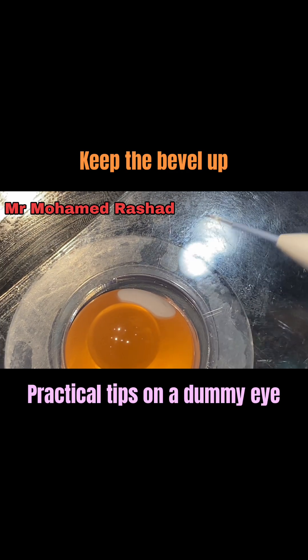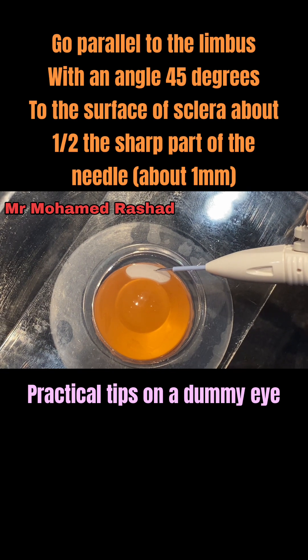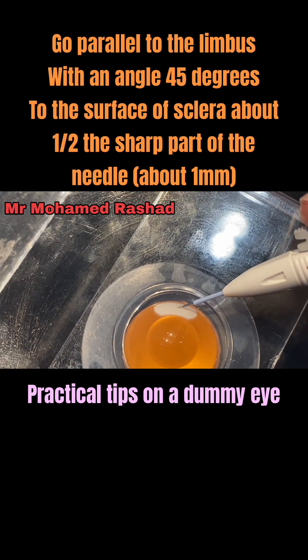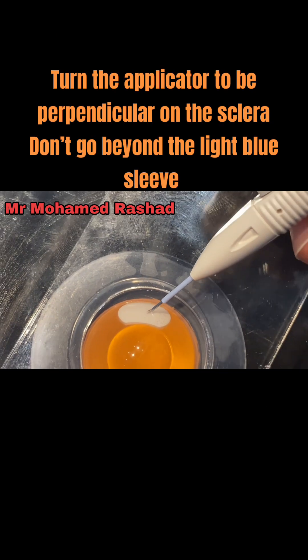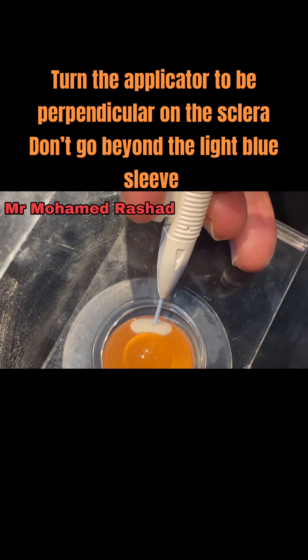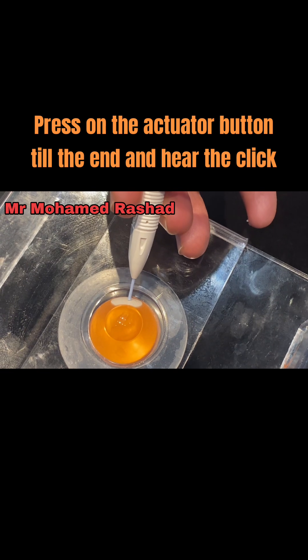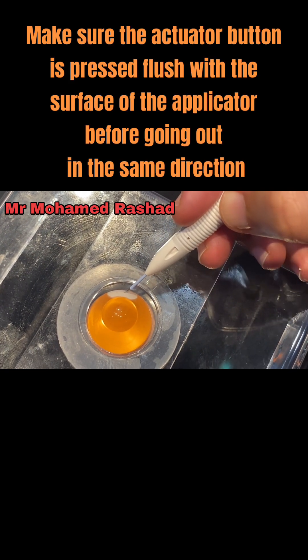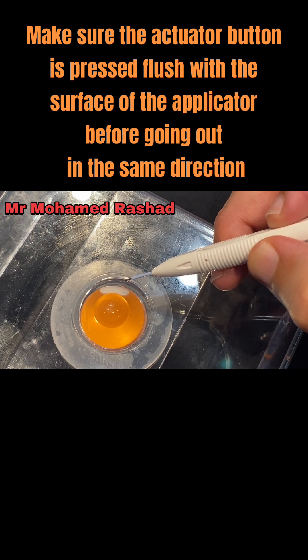Keep the bevel up. Go parallel to the limbus at a 45-degree angle to the surface of the sclera, advancing the sharp part of the needle about one millimetre. Turn the applicator to be perpendicular to the sclera. Don't go beyond the light blue sleeve. Press the actuator button to the end and hear the click. Make sure the actuator button is pressed flush with the surface of the applicator before withdrawing in the same direction.